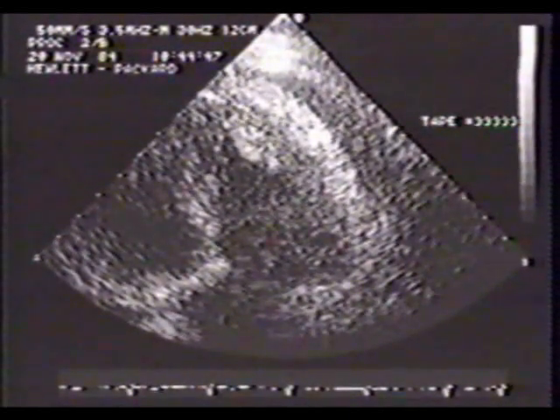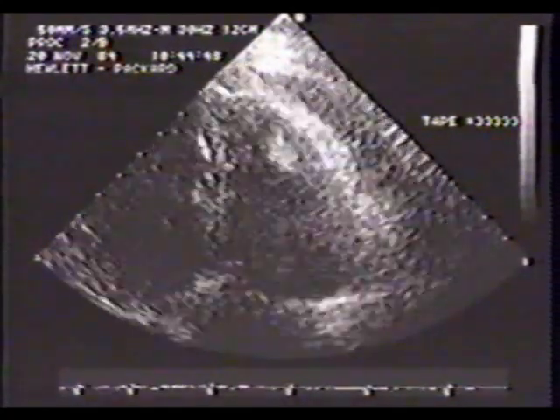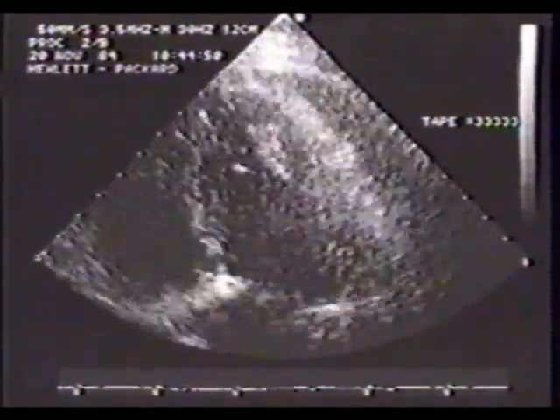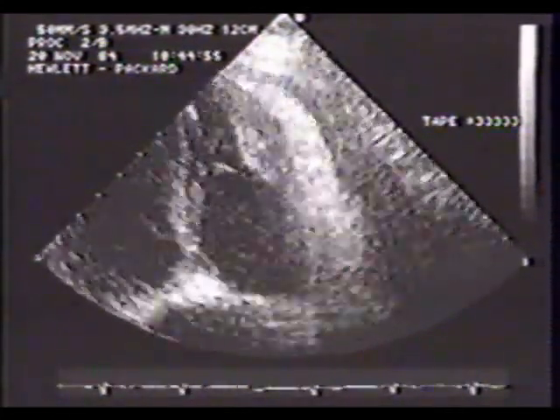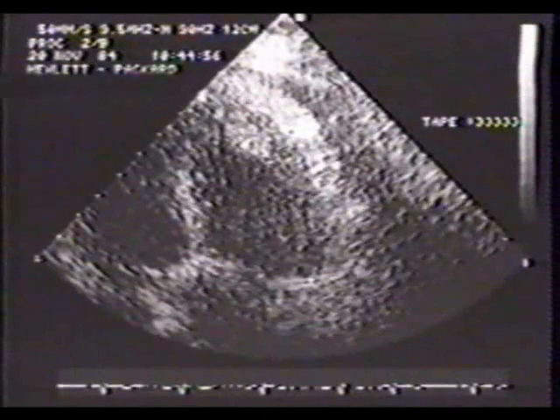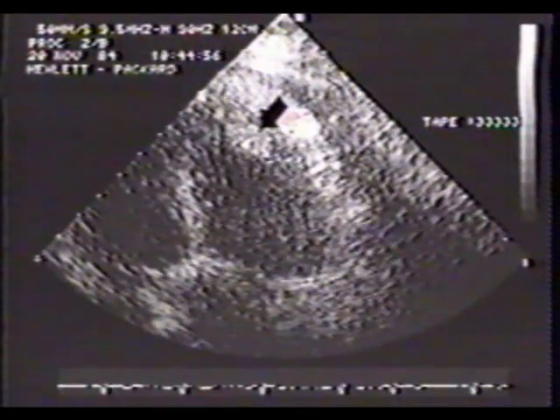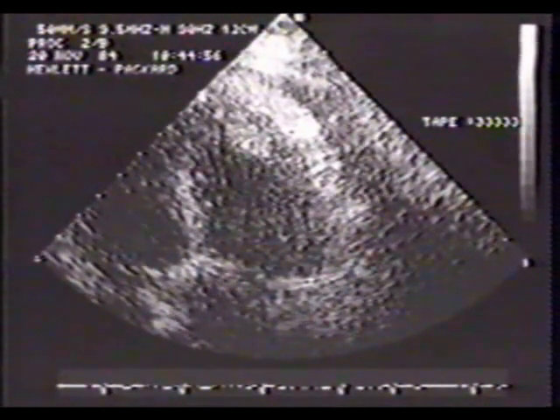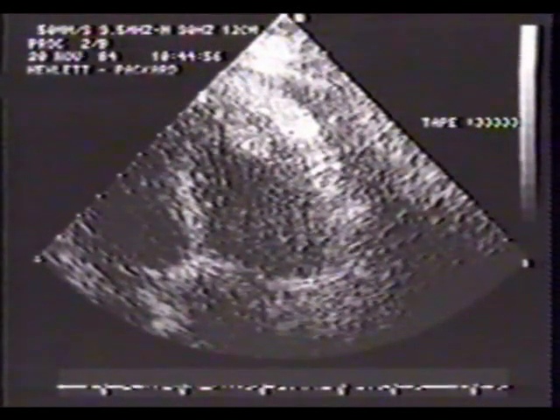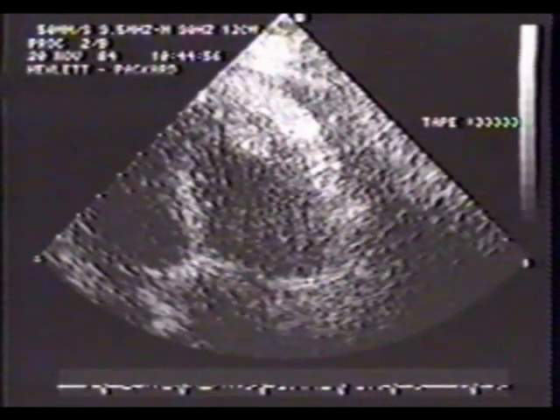The image has been expanded to concentrate attention on the thrombus. Right ventricular mural thrombus is a well-recognized complication of RV infarction. Dislodgement would, of course, result in pulmonary embolism. Therefore, despite the small effusion, this patient was placed on anticoagulants. She went through her rehabilitation program without incident.